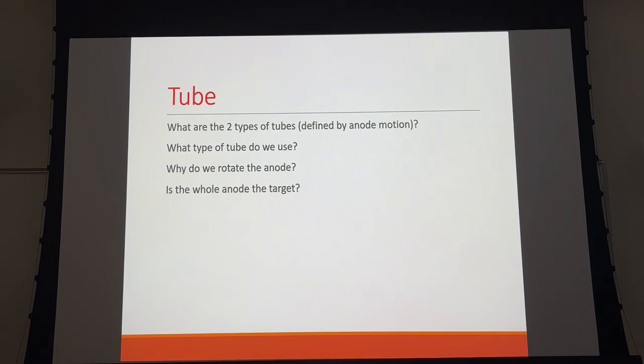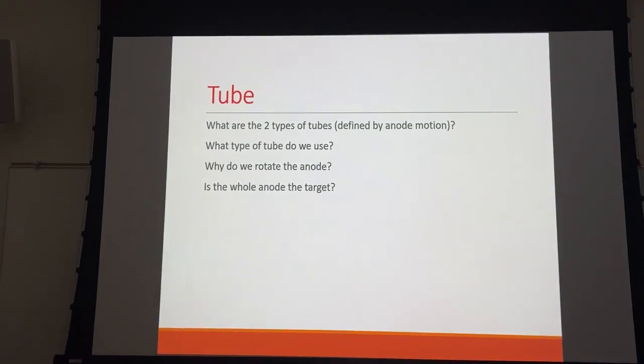X-ray, if you remember, in dental, they call the dental tubes self-rectified units because they don't use any rectifiers, so the X-ray tube becomes a rectifier. That's still registry testable. For what reason, I can't tell you. I don't know. So we use rotating anode.